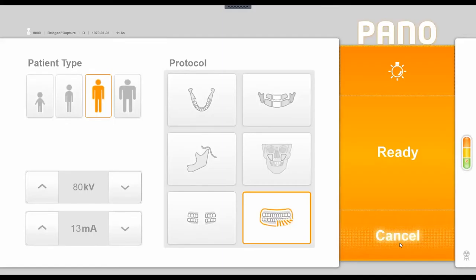Once we have our patient positioned using our positioning lasers and the appropriate chin rests, we would then click ready. The machine would move into a ready position. The LED above the x-ray generator would turn from blue to green, and once it's green, that indicates that when the user presses the exposure switch and holds it down, that LED will change to yellow and actually begin to emit radiation and acquire an image.